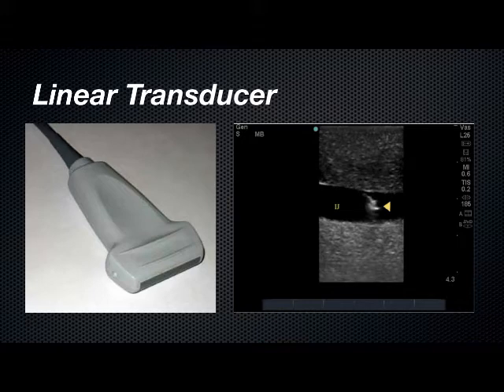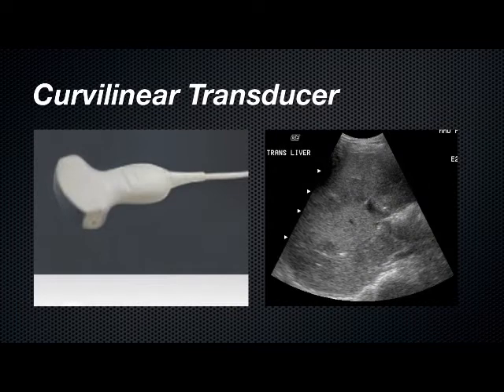on the screen. And so if you look on the right picture, there's a little blue dot, and that corresponds to the actual, what we call probe marker on the ultrasound itself. So the probe marker is also the little dot on the left picture here. And then this is an example of what a curvilinear image will look like. And again, the image on the right-hand side, there's a GE on the upper left-hand side, and that's towards the patient's head, and that corresponds to the dot that's kind of difficult to see in this image.